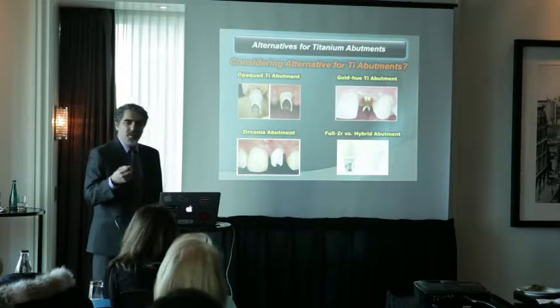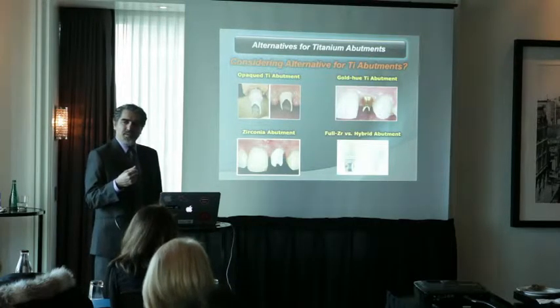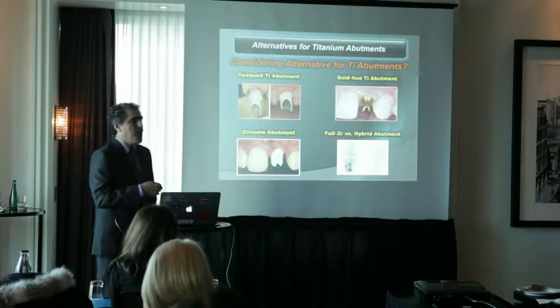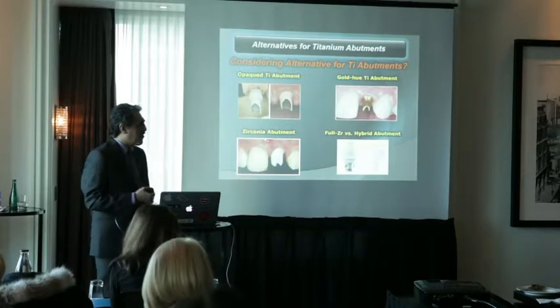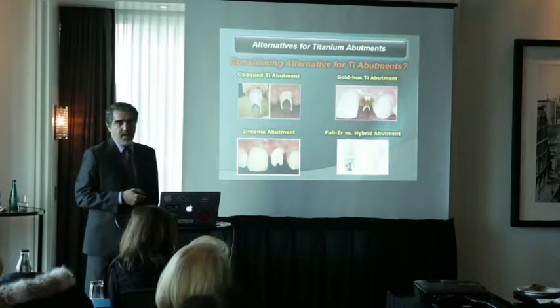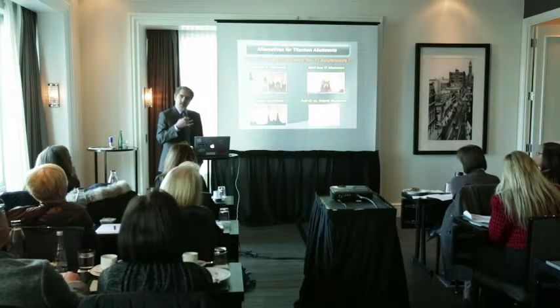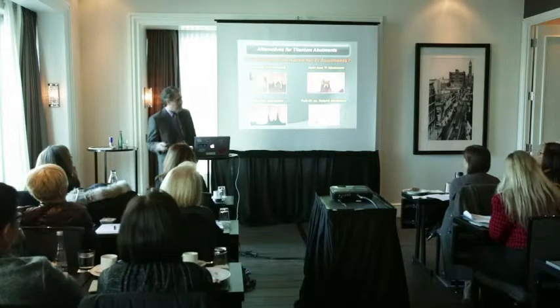Even with touching with your fingers, after a while the coating is going to be somehow degrading, and it becomes more and more dull and kind of gray. So long-term, there are no long-term studies on them, but there is a chance that this gold hue would fade away, and then after that you're going to have again the gray problem.